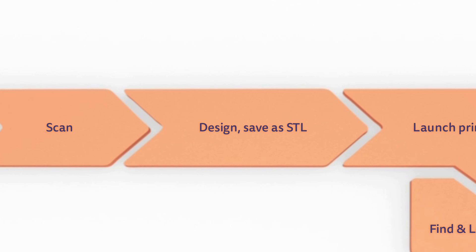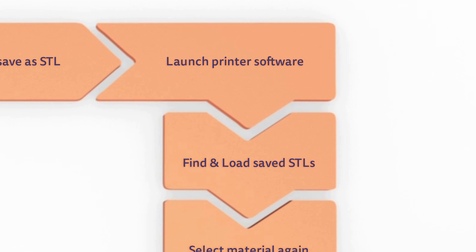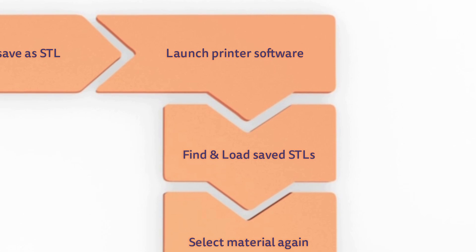Then the printer software, a separate standalone application, is launched. In this software, you must locate and load the STL files for a specific case. In complex cases involving both 3D printing and other production methods, this can be error-prone.